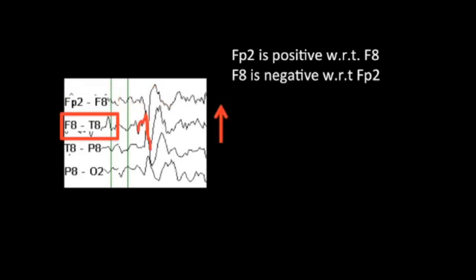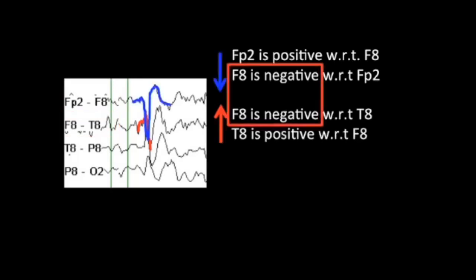If we look at the next channel, which is F8-T8, we see a slight upward deflection at the sharpest point. We can say that this would suggest that either F8 is negative with respect to T8, or T8 is positive with respect to F8. What we see in common between these two tracings is that F8 is relatively negative in both channels.